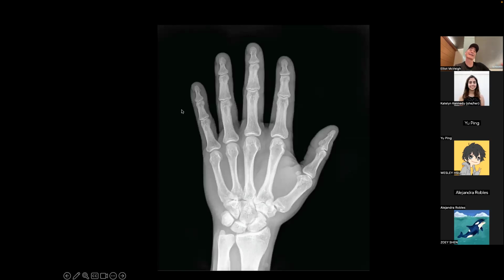This is actually a negative of what is detected, because the bright stuff here actually absorbed more photons than the dark stuff. Okay, so they've inverted the contrast. And the reason you invert the contrast is that it looks like the object itself is illuminating the space as opposed to being a shadow.